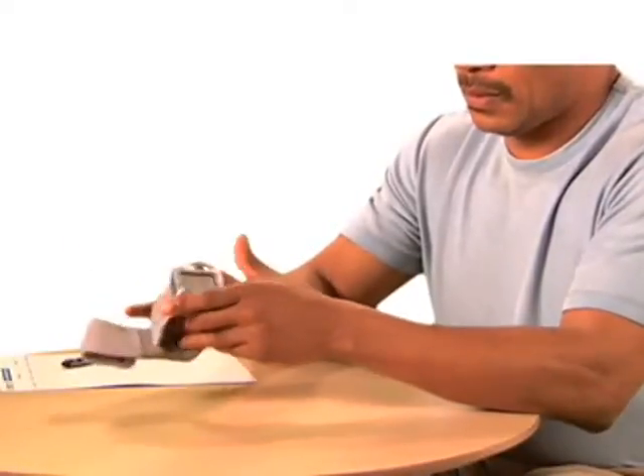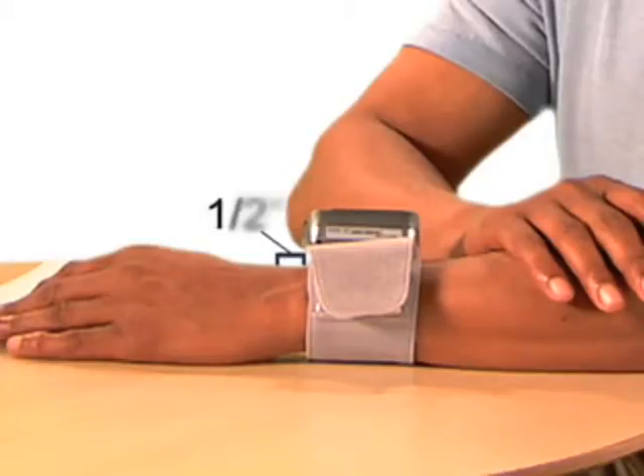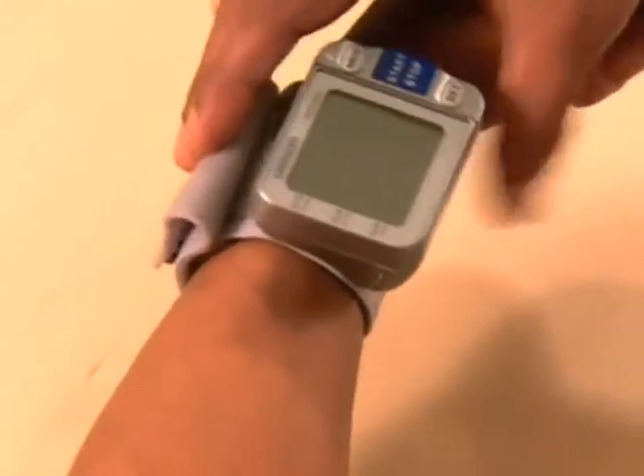Secure the cuff on your left wrist and align the monitor with your thumb. Place the cuff ½ inch away from your wrist bone. Hold the bottom part of the cuff and wrap it around your wrist so it fits comfortably and securely.